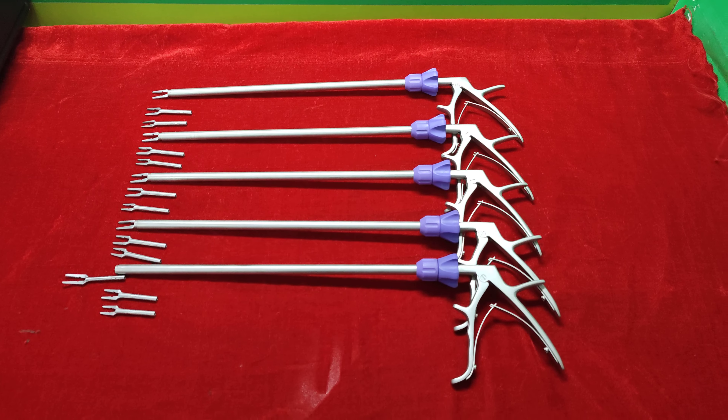These instruments are reusable and autoclaveable. You can also rotate this jaw — this is rotatable.